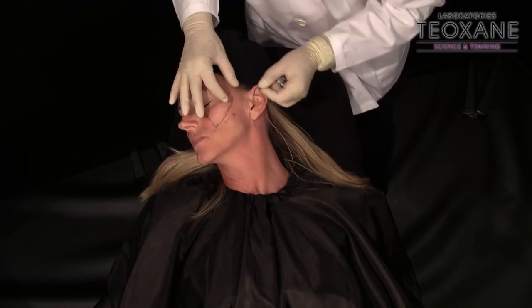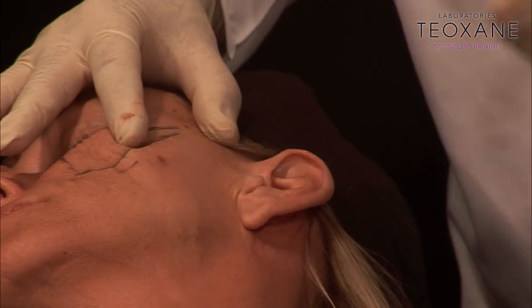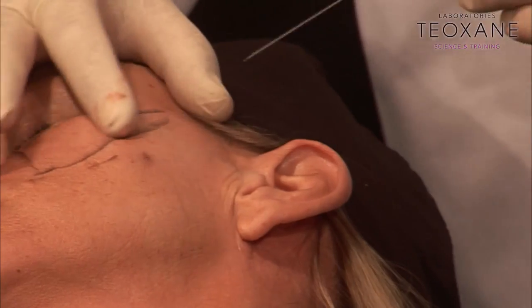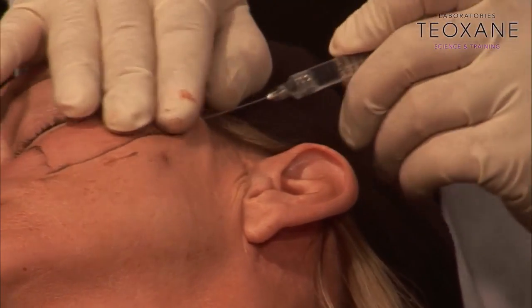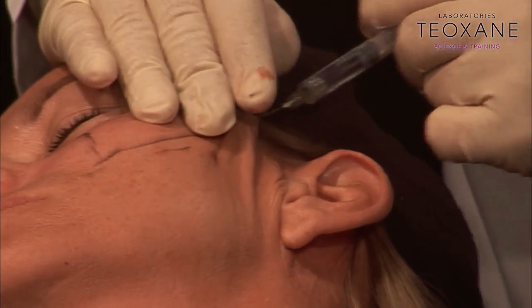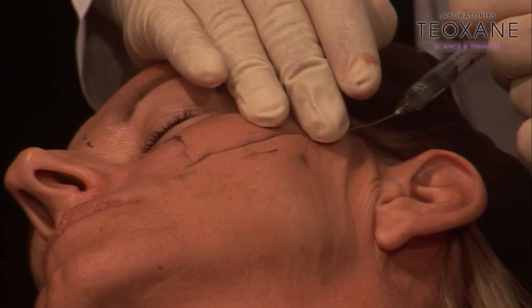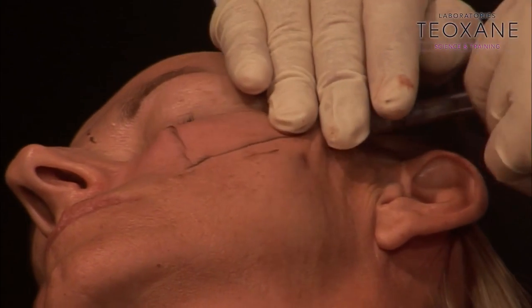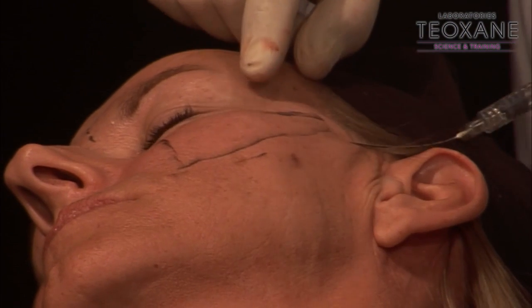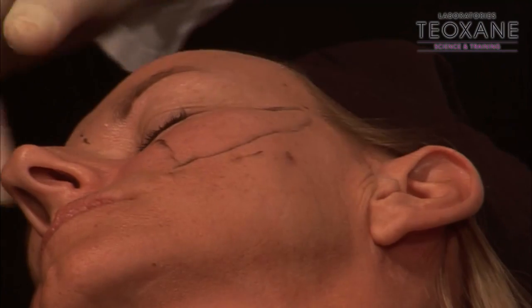Let's go. I'm just gonna do a little prick, tiny, tiny, tiny, tiny. I didn't do anesthetic. Keep that on the side. So I'm going to see very quick. I quite like this cannula. They're very strong, flexible but quite strong also. You see? Voilà. I don't interfere with the eye socket area, as you can see. Okay, done. The other one, please.